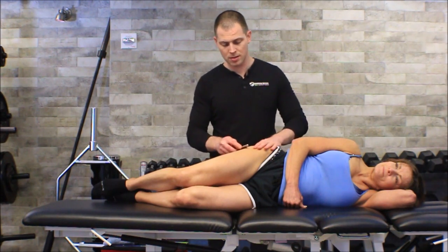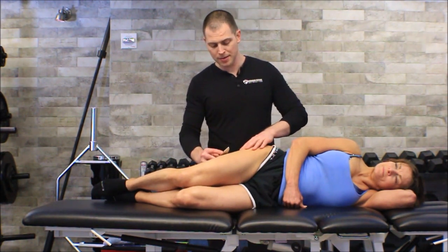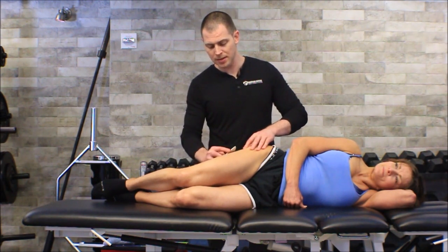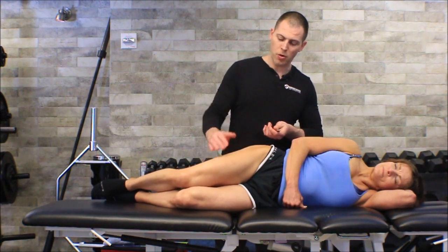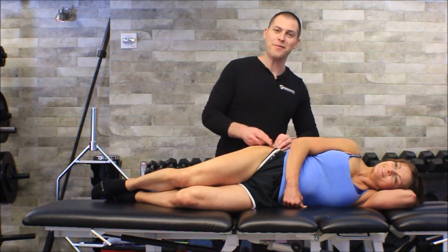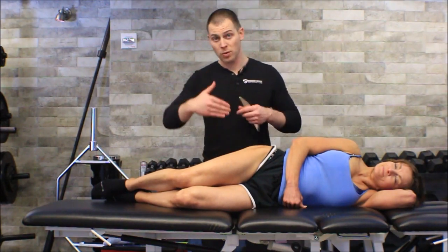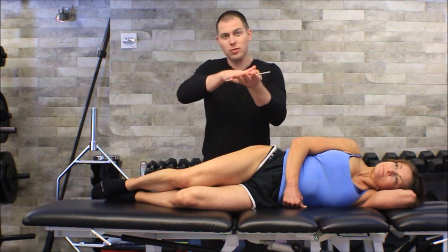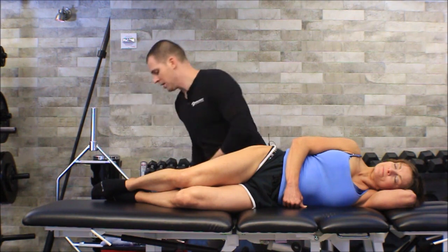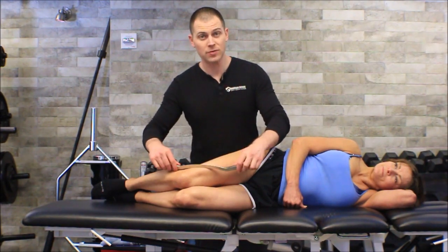Going the other direction now. So far I feel a little more dysfunction in here and a little further back, especially as we come up to the midpoint of the posterior part of her vastus lateralis, and her TFL is definitely a little bumpy. So now we have some areas we want to address with multi-directional strokes to get those layers moving a little better. I'm going to use this broad tool because we're doing nice big broad areas — but be careful because this tool is heavy. On the lateral thigh, you don't need much more than the weight of the tool as far as pressure.